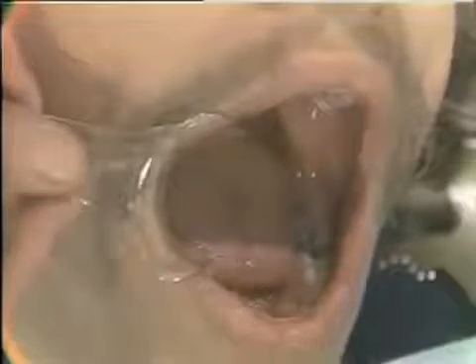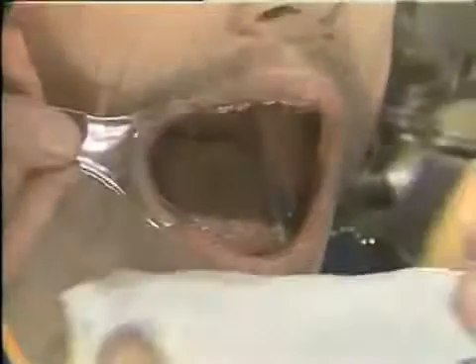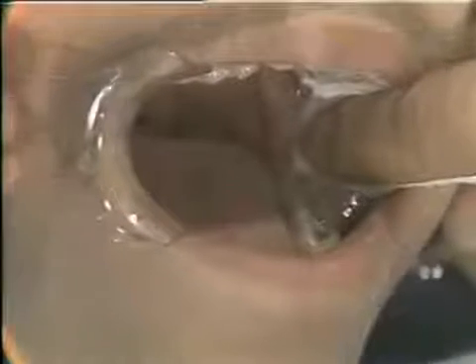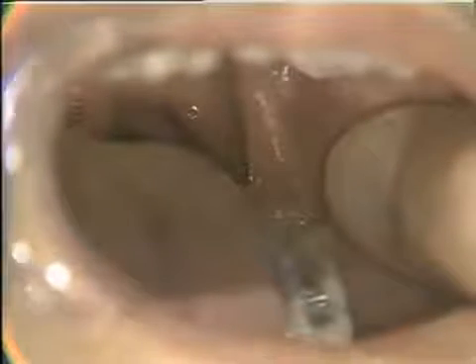Now, to demonstrate drying the mucosa back in this area, you'll notice that I do have a gauze strip here that I've unrolled to its fullest length, and I place my index finger over the end of it in this fashion. We just kind of sneak along his occlusal plane and lay it on the mucosa in that area. Don't wipe, because many patients will gag if you stimulate them in that fashion. I just lay it there for a few moments, and then with my left hand, I remove the gauze, and at the same time, my thumb is going in to get our landmarks. We have the mucosa dry. I do have my landmarks, with my thumb and second finger on the posterior border of the ramus.